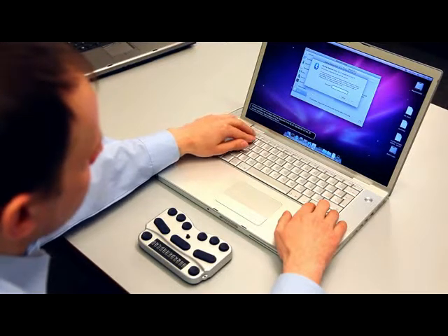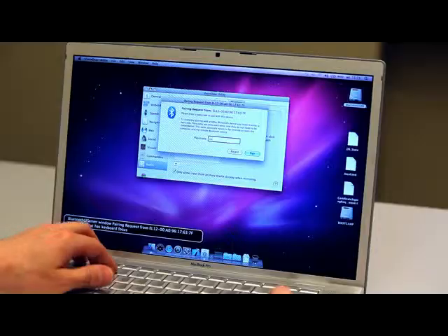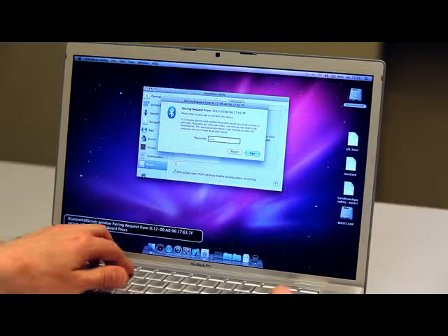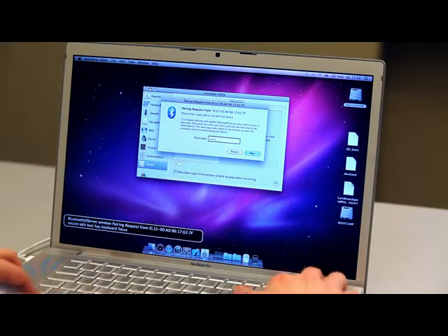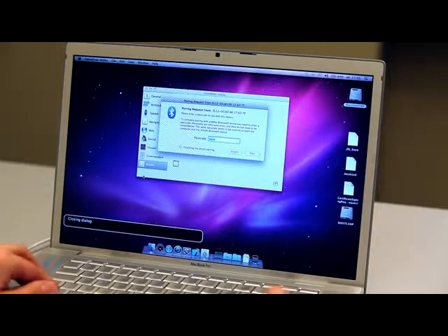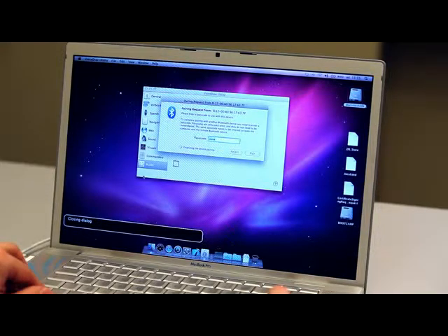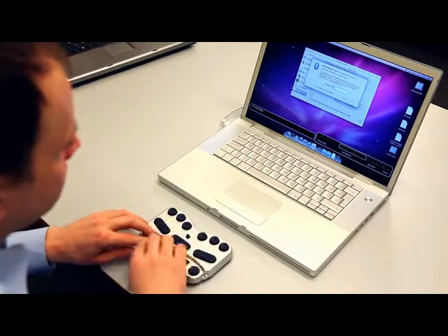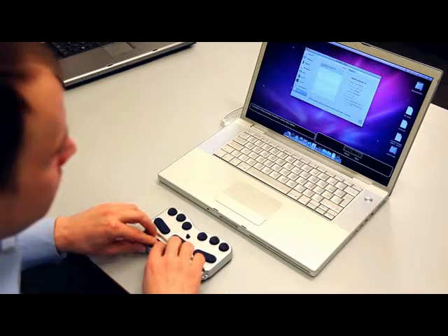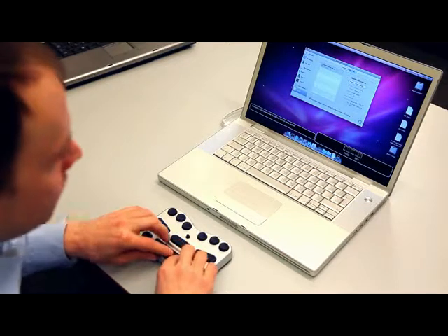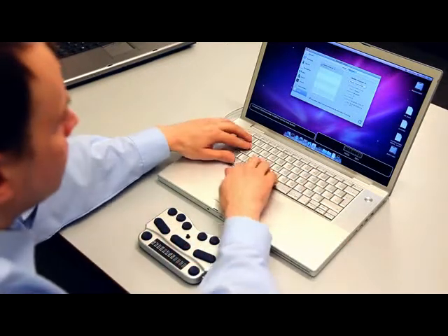You will then be asked to provide the pairing passcode 1234. Enter the passcode from the Mac keyboard and press Enter. You will hear a single beep from the Braille Pen 12 to tell you the connection has been made.